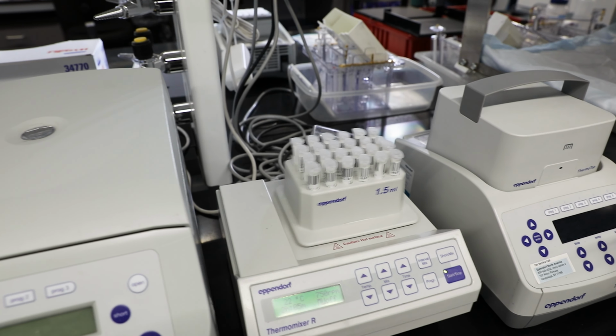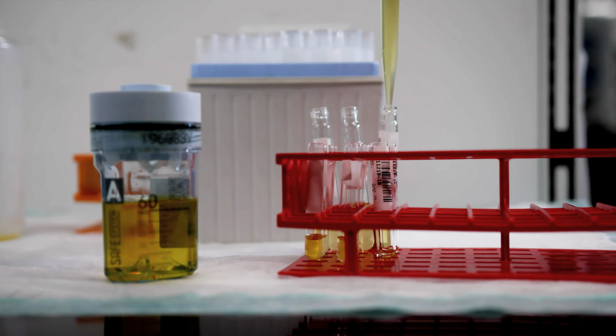There's been a lot of really good improvements in the last 20 years in anti-doping science and techniques. But I think some of the things that we're most proud of is the alternative matrices. These are non-traditional testing matrices. Most of the testing was usually done in urine and also in blood that's drawn from the arm. There's been a lot of advances in looking at alternative matrices. The advantage is they're less invasive for some of the testing programs, so it's easy for athletes to test. You can do the testing anywhere in the world. They're cheaper and more convenient. And importantly, some of these alternative matrices will also give you different information, so you can hone in on different periods of time on use and so forth. There's been some great improvements in that area that we're very proud of.